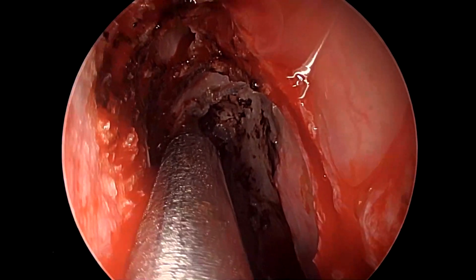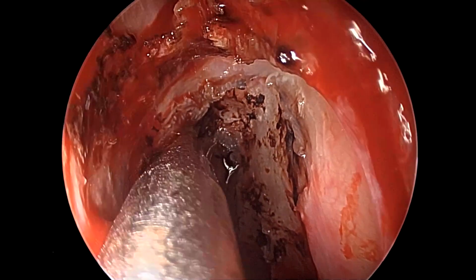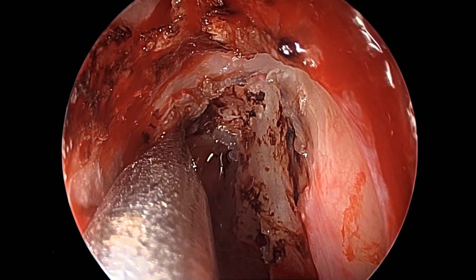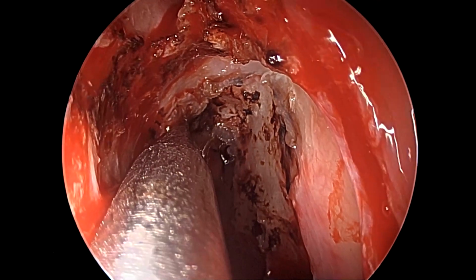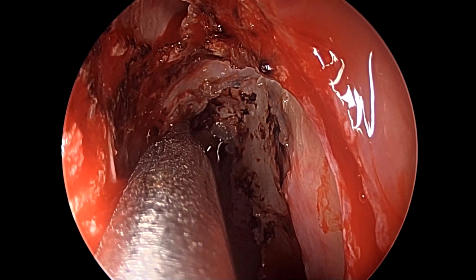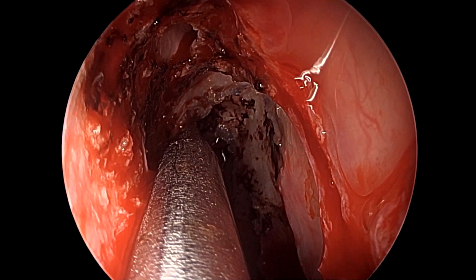It makes the surgery more precise, the outcomes more consistent, and if it is available in the theaters, it must always be used. There is no excuse for not using it if you have it available. Though it's not compulsory, one can definitely close these defects without it as well. But its presence in the OR should be considered as a mandatory indication to use it in these patients.